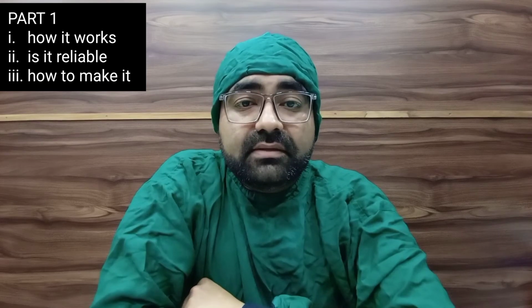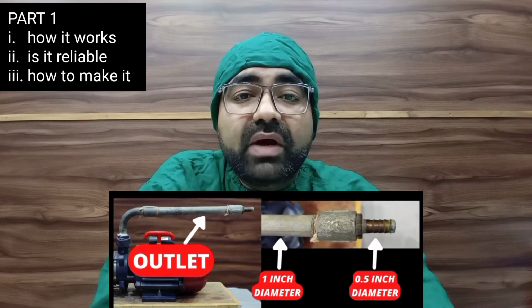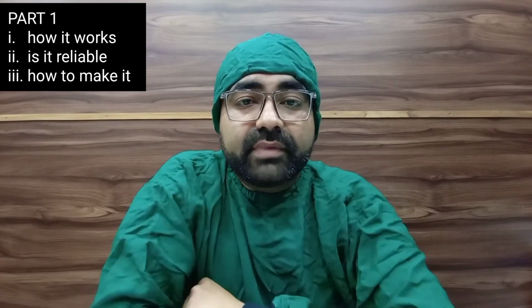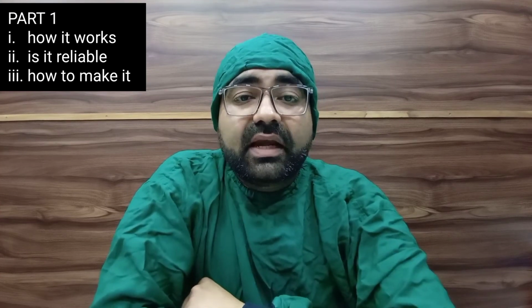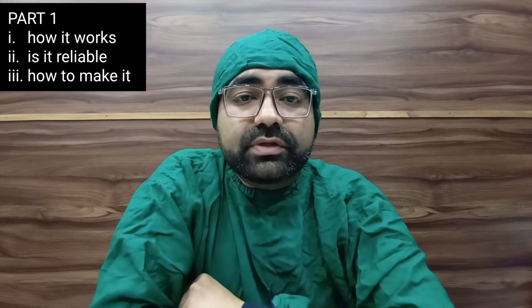In my motorized suction, you can notice I have reduced the diameter of the outlet pipe from 1 inch to 0.5 inch. The reason for this is the liquid passing through a narrow pipe has more force.